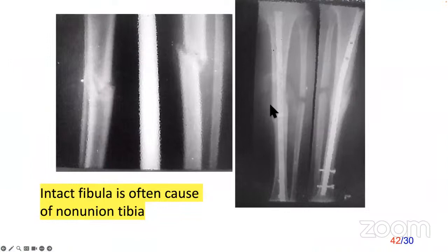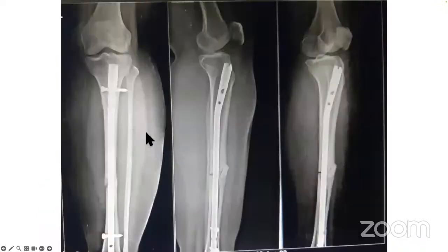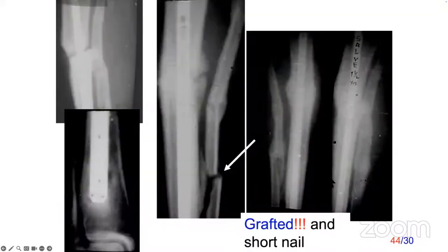The chances of non-union in the tibia with an intact fibula are higher. This is a debatable problem, but as you can see, this undisplaced tibia fracture, so conserved, did not unite. So ultimately, the treatment was fibular osteotomy and nailing in a dynamic mode. I have not put in any screws there, and this is done. The same thing here: nailed, but again it goes into non-union. So the treatment is fibular osteotomy and then put in a nail, and then it becomes all right.